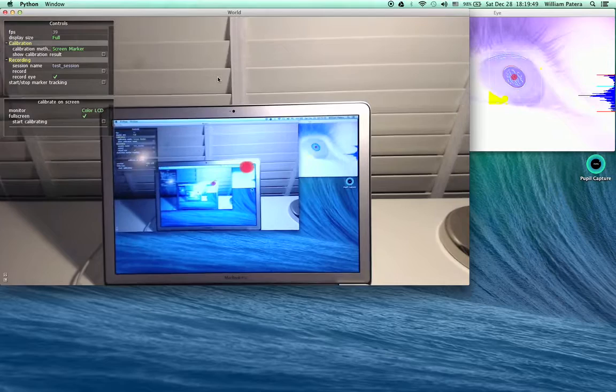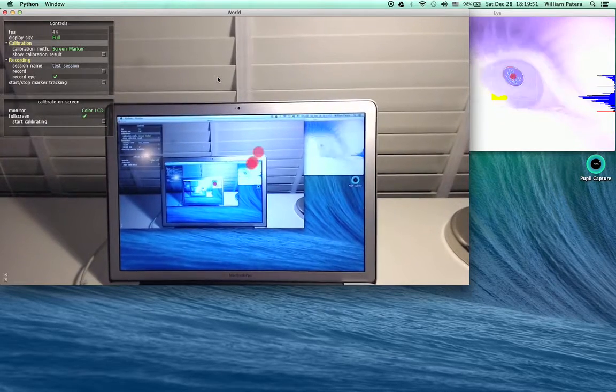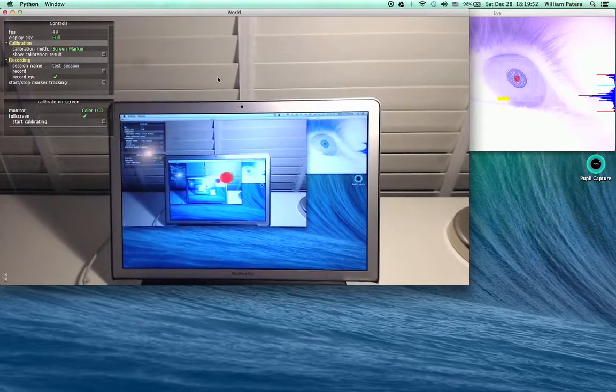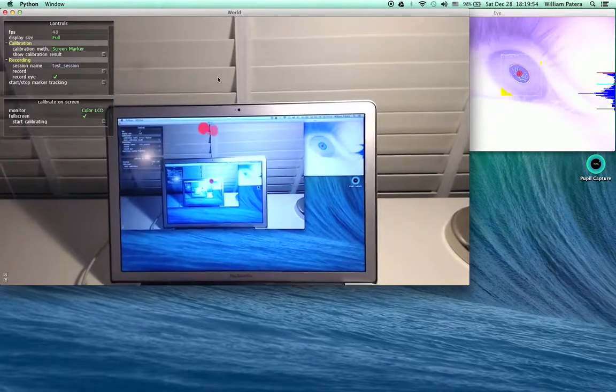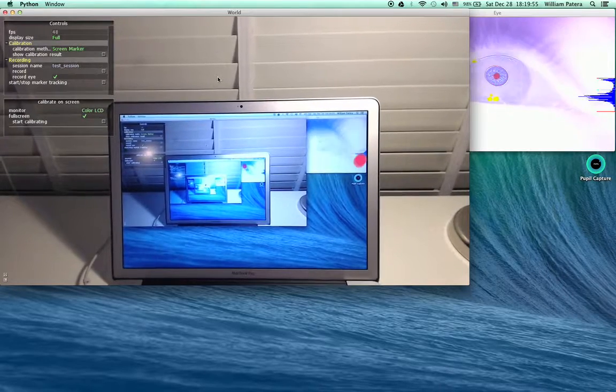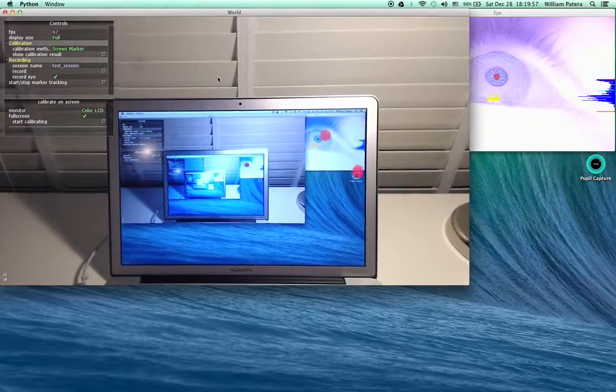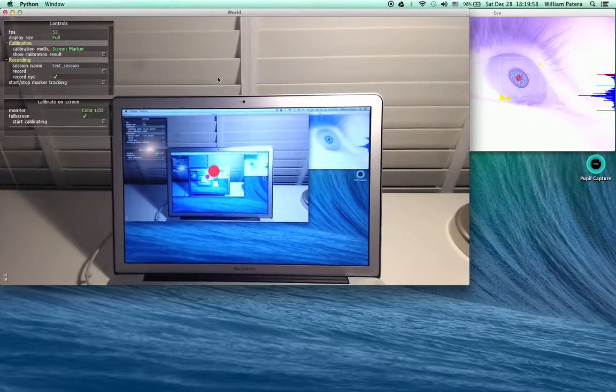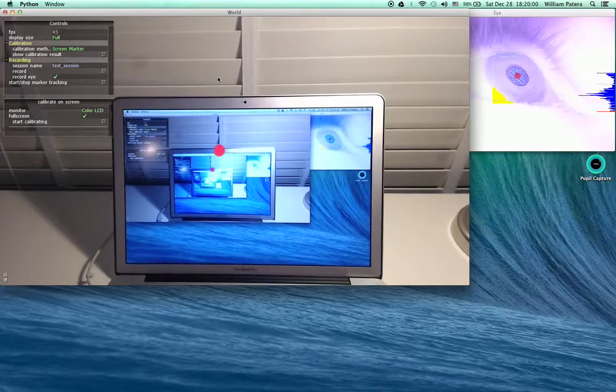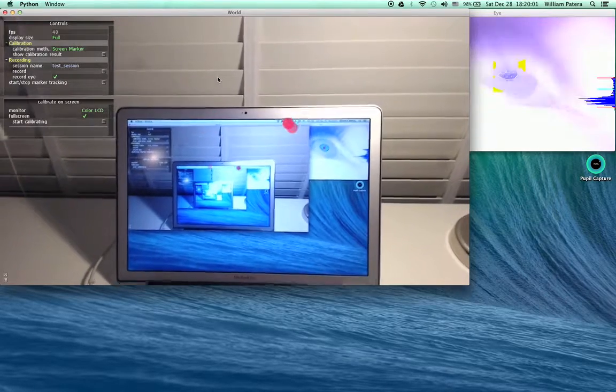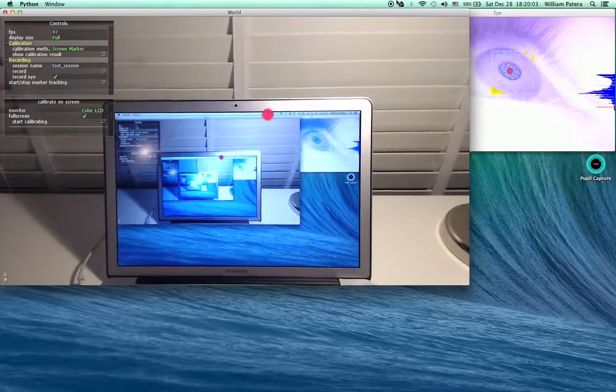This concludes the simple walkthrough for how to set up, calibrate, and record using Pupil Capture software version 0.35. I hope this is helpful.